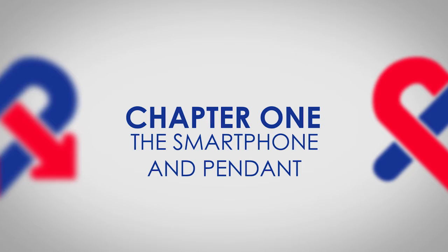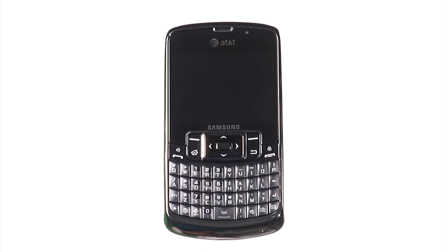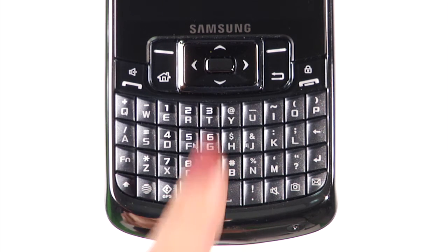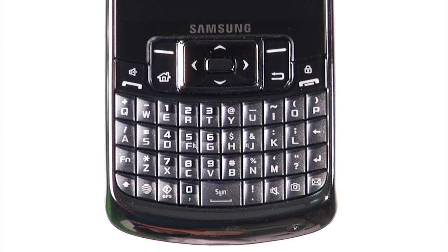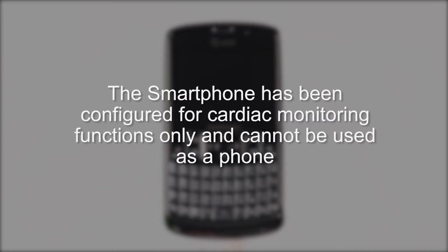Chapter 1: The Smartphone and Pendant. Let's first become familiar with the MEDICOMP Smartphone. There are a few buttons you will use throughout your procedure: the ON-OFF button, left soft key, right soft key, select key, directional arrows, and back key. You'll also be using the charging port. The smartphone has been configured for the cardiac monitoring functions only and cannot be used as a phone.